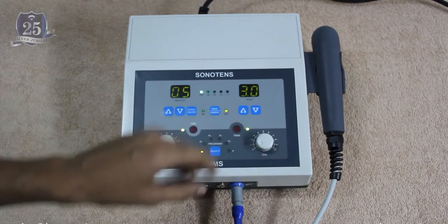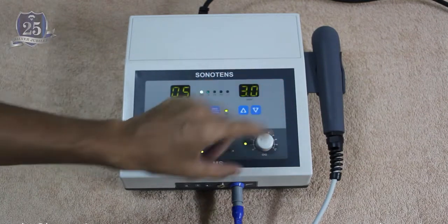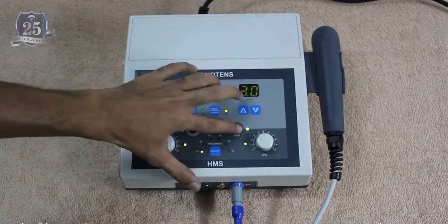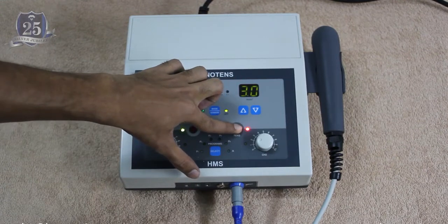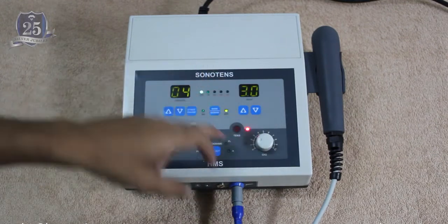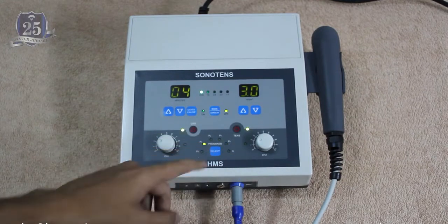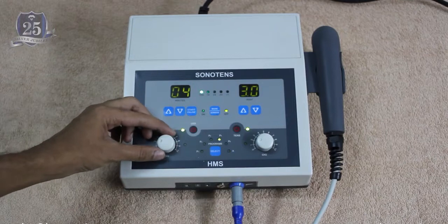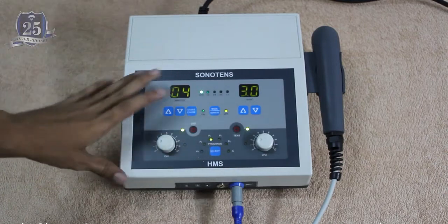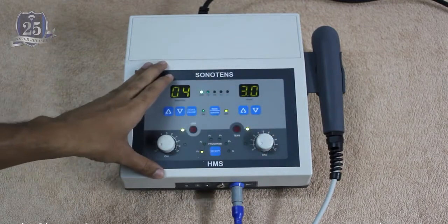So there is a unique safety feature with the TENS mode. So for example, if you switch on any one of the switches with the channel 1 or channel 2 of the TENS, and so the switches in the channel 1 and channel 2 are on state now, and if you're by mistake switching on the TENS, then the machine will give you a warning sound that the intensity switches are in on state. So this will prevent the sudden surge of power to the patient. So this is one safety feature available with the TENS mode. Now I am switching off both the intensity controllers.